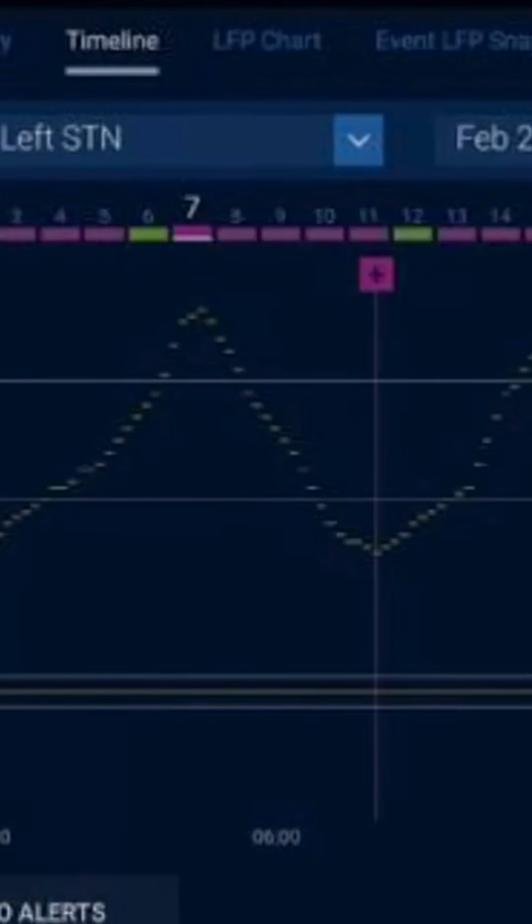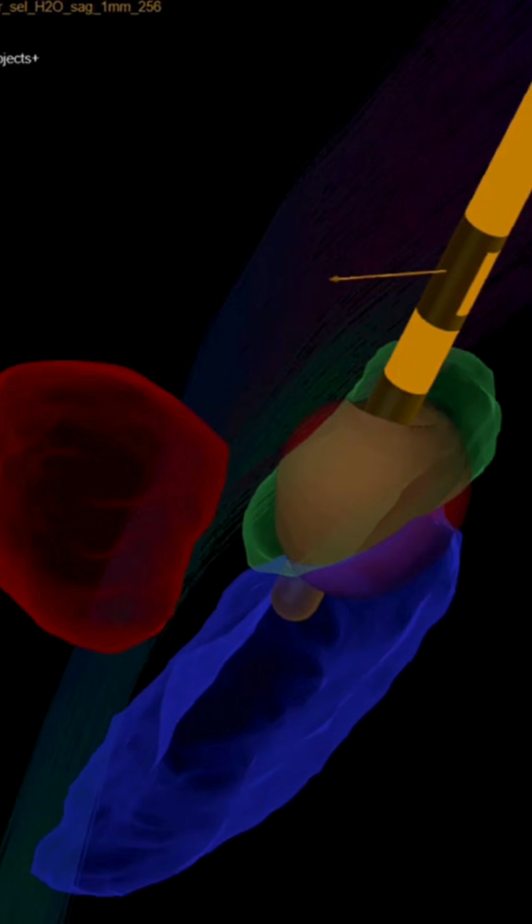Similarly, in case of Parkinson's disease, the amount of abnormal activity within the motor circuit of a Parkinson's disease patient varies across the day. So initially, when we placed a DBS electrode, we would fix the current parameters to a particular rate and the rate would remain the same throughout the day. Now because there was variation in the abnormal activity, there were times in the day when the patient was absolutely normal and there were times when there was understimulation and times when the patient was overstimulated.